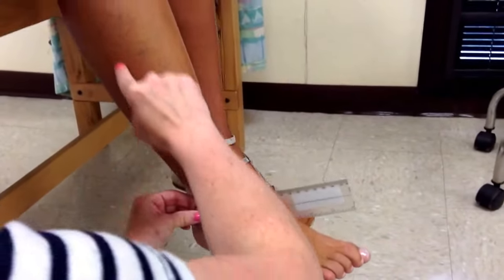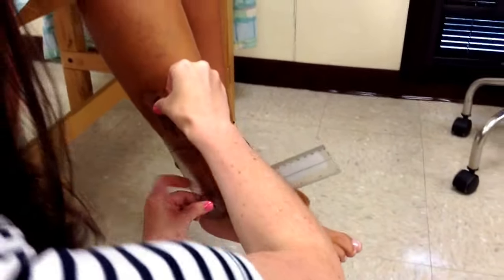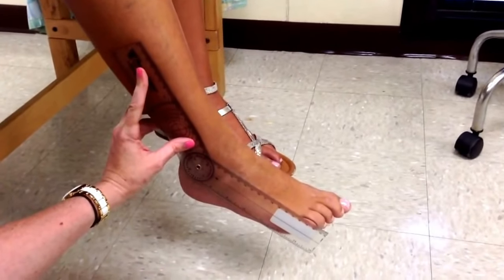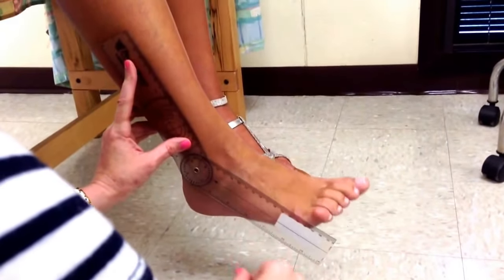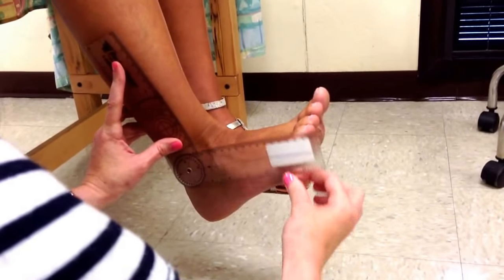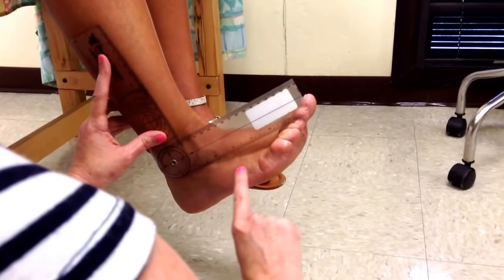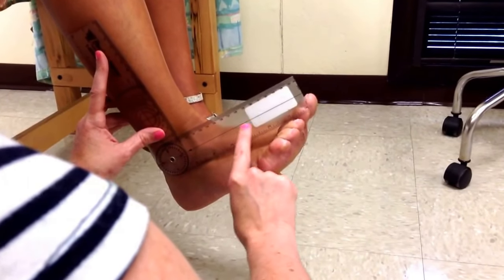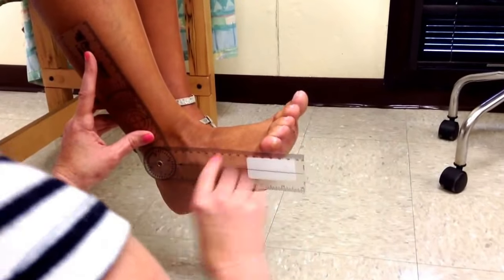For dorsiflexion, the fulcrum is going to go right over the lateral malleolus. The stationary arm is going to line up to the fibular head. I usually hold it with two fingers like this so it's completely still. I'm going to say to the patient: I want you to bring your toes up towards your face as high as they'll go. The moving arm needs to be parallel with the fifth metatarsal — the lateral aspect of it. If I put it like this, that's not parallel.